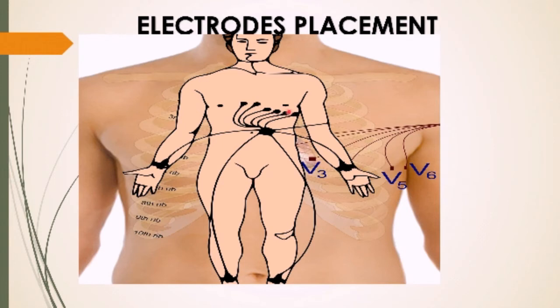Now let's see C5. We say you place it at the same level as C4, but at which position? This is the armpit, or the axilla. Just at the anterior edge of the axilla, or anterior axillary line. That is where you place C5.